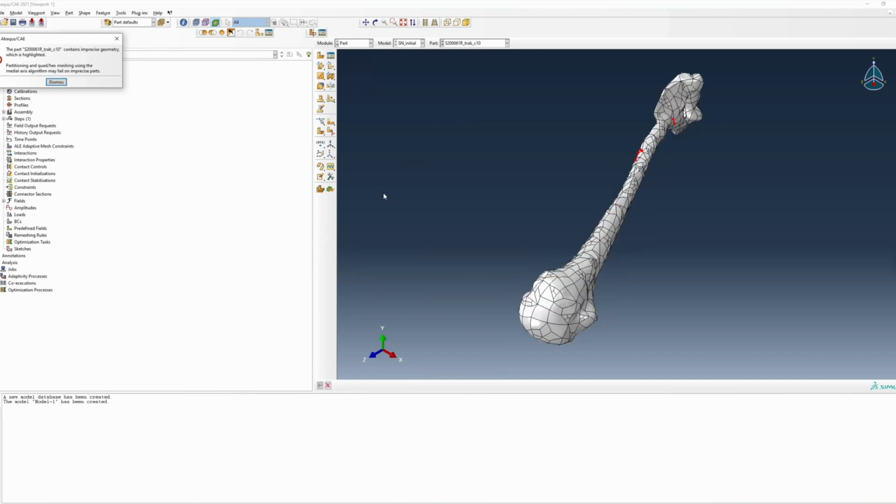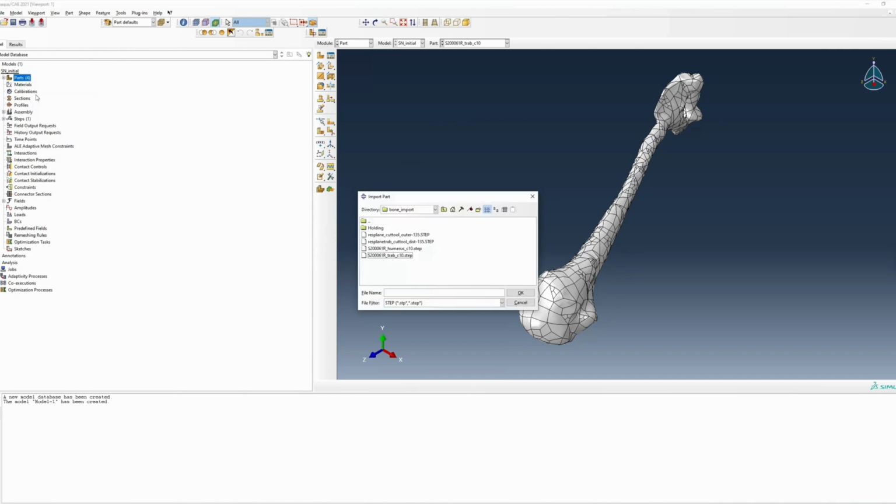As you may have noticed, some of the parts that I'm importing here contain imprecise geometry. This is important if your imprecise geometry is within the area of interest that you're looking at. However, in this case, I'll be resecting off those areas immediately.